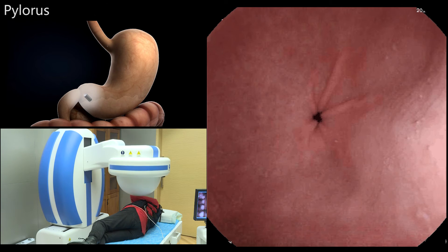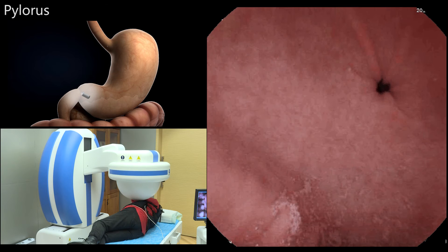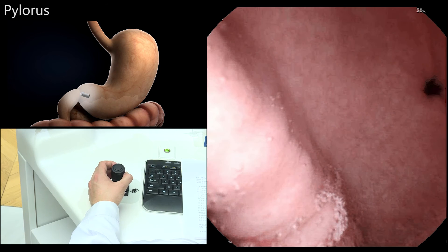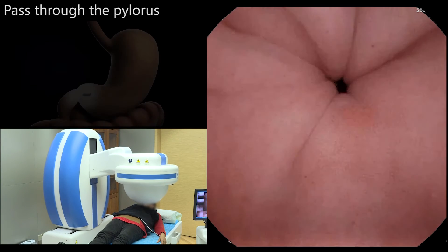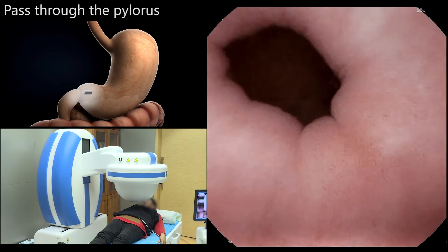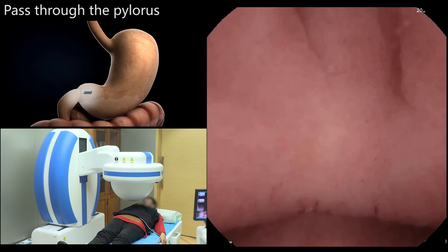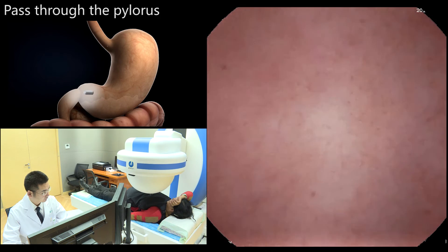With the patient in the right lateral decubitus position, the camera was oriented horizontally towards the pylorus for observation. The magnetic ball was moved toward the abdomen over the gastric antrum. The capsule was then rolled until the camera end faced the pylorus, and the capsule was directed close to the pylorus with the guidance magnet robot.